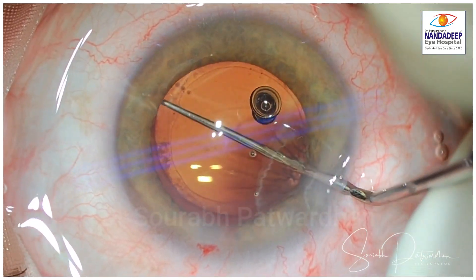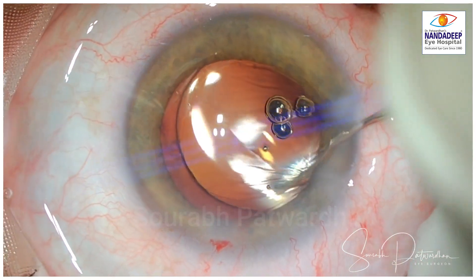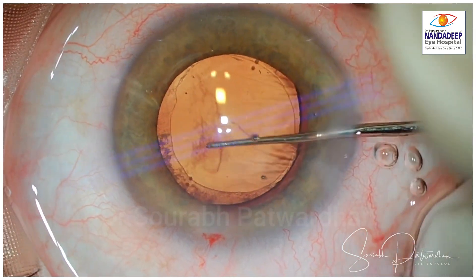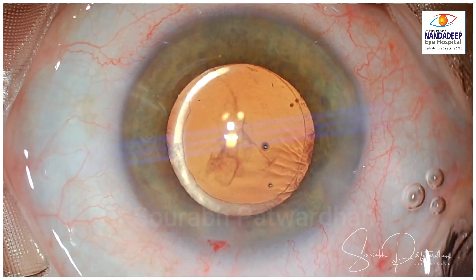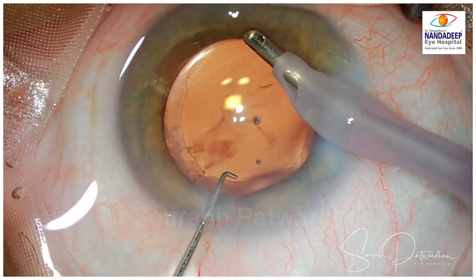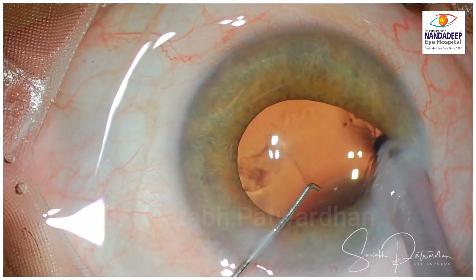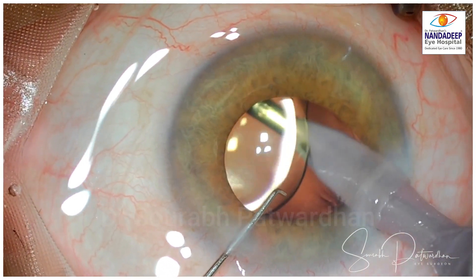I am going to rotate this IOL. It lies around 30 degrees in the anti-clockwise direction. It is easier to rotate these IOLs in the clockwise manner because of the haptic positions than the anti-clockwise, though anti-clockwise is possible. The removal of OVD from the posterior surface of the IOL is very important, which is why I prefer cohesive OVD — it comes off very quickly.